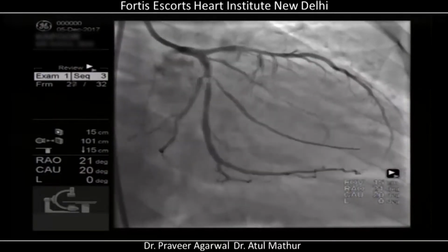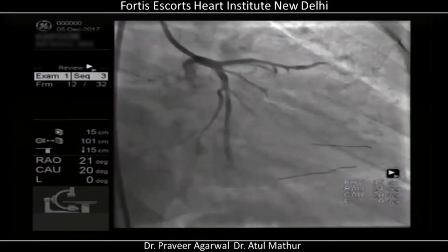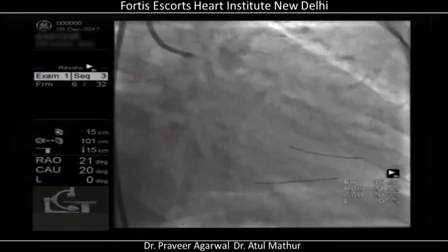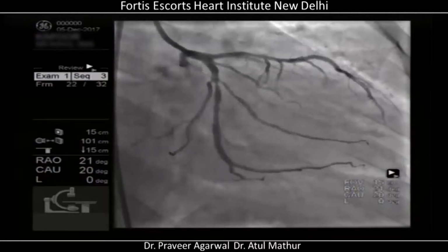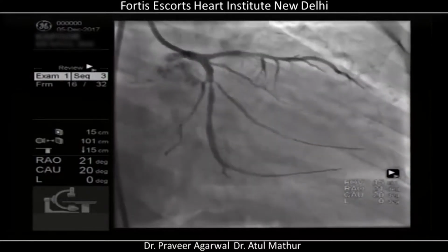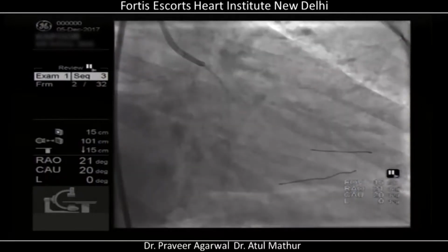So once you prepare your branches, then you will deploy the stent first in the side branch and do a POT after this. And here in our case, how this stent will break up is, there will be a 10 millimeter in the proximal main vessel, there will be a 3 millimeter for the bifurcation area, and there will be a 6 more millimeter into the side branch. So unfortunately in our case, the side branch is longer than 6 millimeters, so we may have to deploy another normal stent into the side branch beyond the bifurcation stent branch segment.